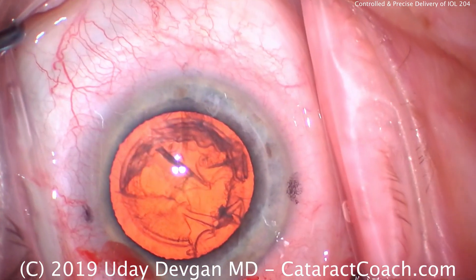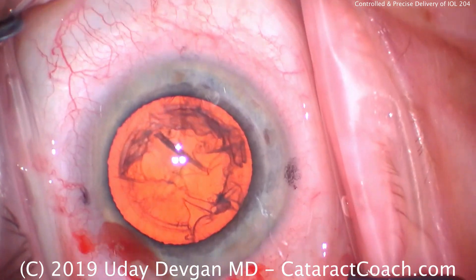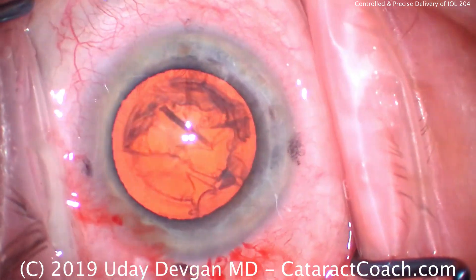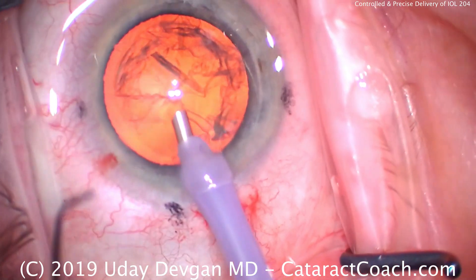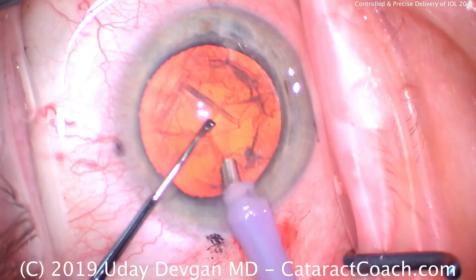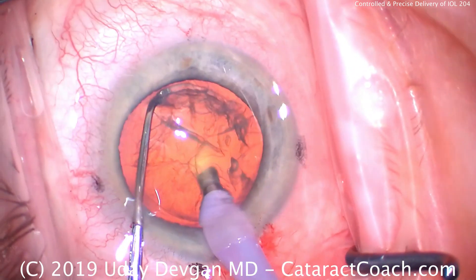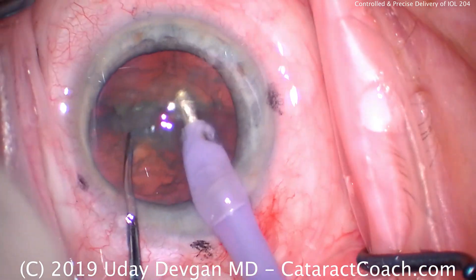A little more dispersive viscoelastic to protect the corneal endothelium, and we're going to put the phaco probe in the eye. Here comes the phaco probe. We've got our chopper in our left hand. We'll chop this nucleus a couple of times and then just remove the pieces quite easily. Buzz into the nucleus — here comes our chopper.